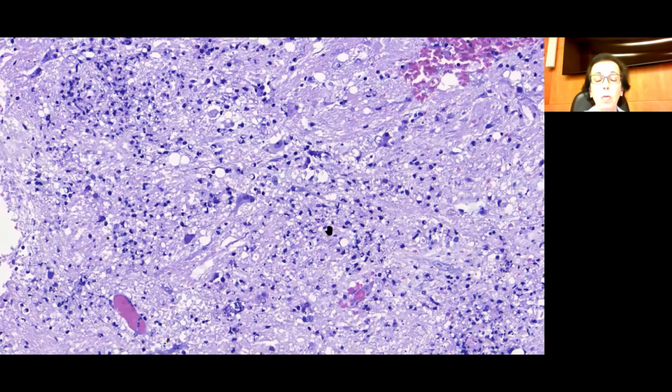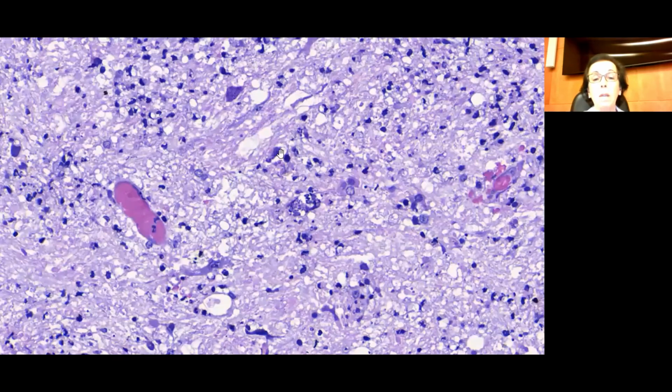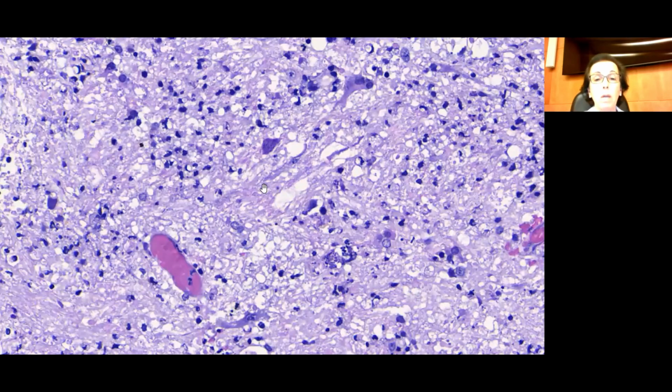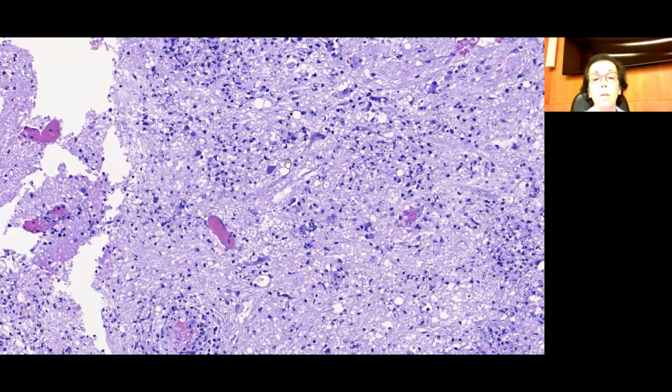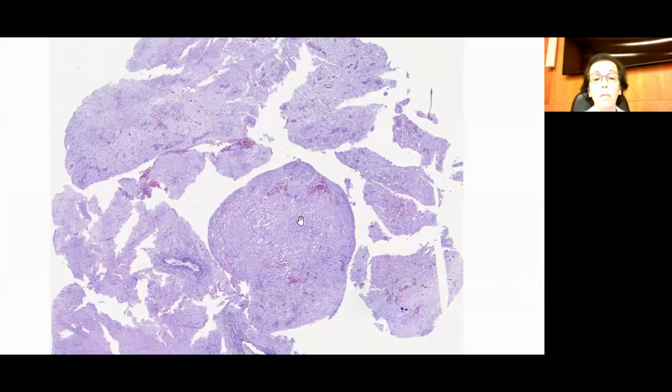Yes, here, I also showed. Here there are some free forms. Look here. And here a cyst. It's not so nice as that one. So this is a cerebral toxoplasmosis. It can be easy, but can be difficult, and sometimes we have to look for them. That's it.